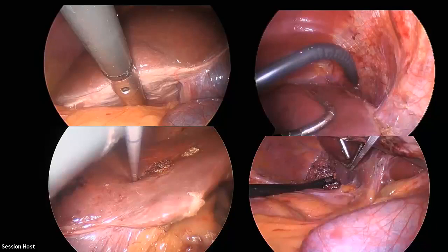The other nice thing about ultrasound is you can get everywhere in the liver very easily, which is another advantage for surgeons relative to IR. They are sometimes using a scanner or an MRI. For us, we can put an ultrasound on any part of the liver. These are just examples. If you're working on the low liver, segment 5, and you need to burn something, you can just flip your ultrasound upside down and see it that way if you want to target something where you have a needle coming in front of it. So it still allows you to have a needle that's parallel to your transducer as you advance towards the tumor. Same thing here, looking up over the dome, the medial segment 8/7.